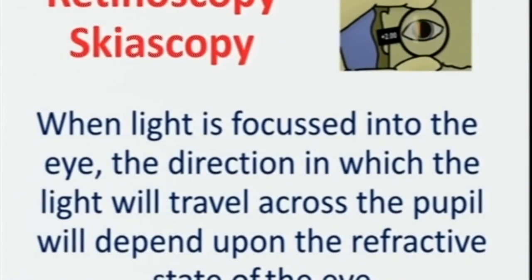So retinoscopy is an art by itself. From the time you see the patient, preliminary, you talk to them, they have to cooperate. Especially children, they'll have all the spasm and all those things. The entire process is very cumbersome. It may take 10 to 15 minutes. Even the doctor may say 5 minutes, but the refractionist will take some time to get a perfect refraction.